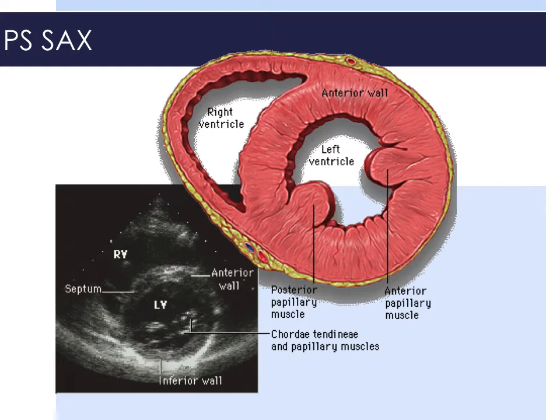And what we see is the left ventricle from a long section becoming a circle, getting a cross-section of the left ventricle. The left ventricle in this view is pretty dominant, it is the best visualized, while the right ventricle is hugging and is around the left ventricle, often appearing as a crescent.